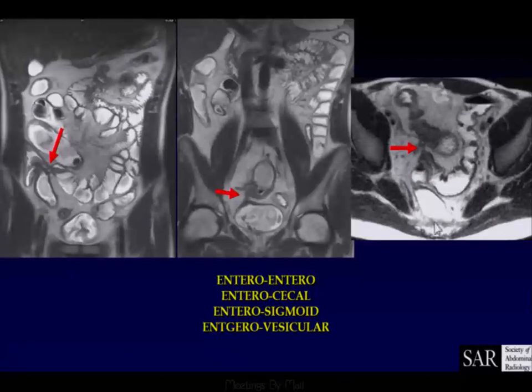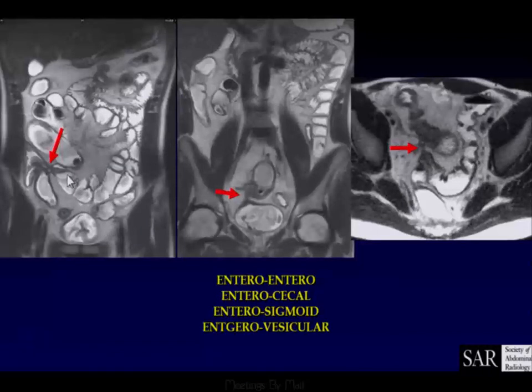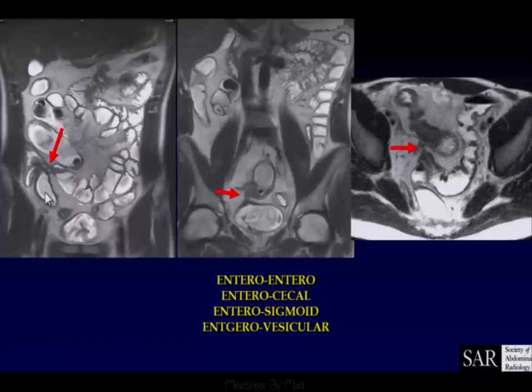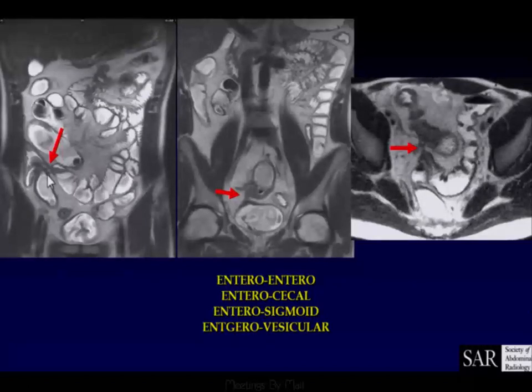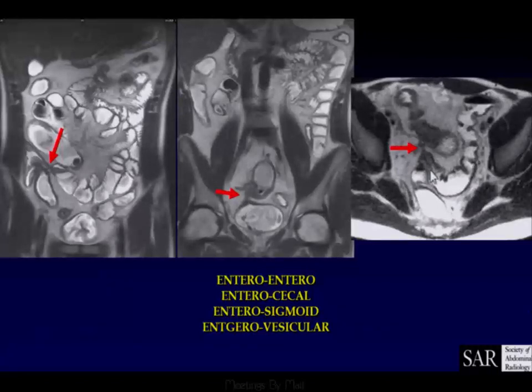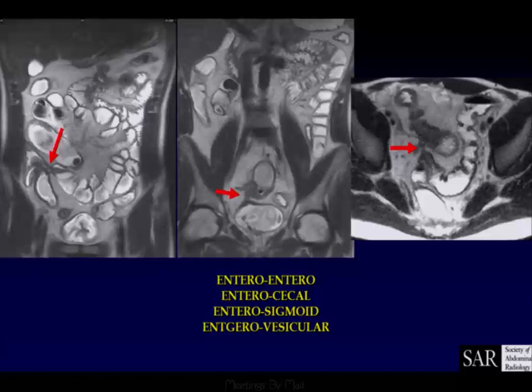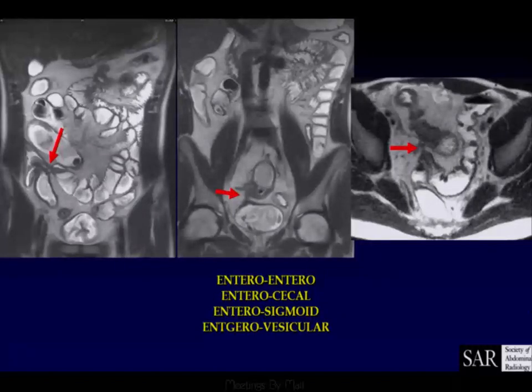MR and CT are basically the same morphologically. Here we've got a complex fistula between a loop of small bowel, another loop of small bowel, and cecum — notice the tethering, angulation, and fixation. We can take barium terms and apply them to cross-sectional imaging. Here's the fistula to the urinary bladder and the fistula down to the sigmoid colon. One comment: I call this a stricture with active inflammation even when there's no upstream dilation because the fistula pops off the pressure. So I still call this stricture with active inflammation with penetrating disease, because that's, in fact, what's happening.